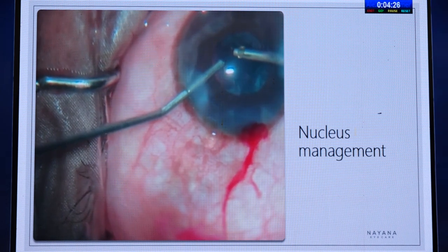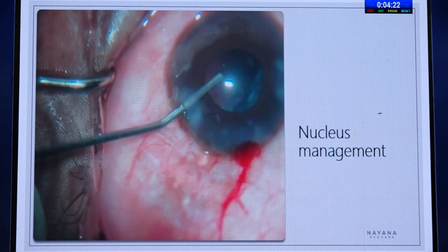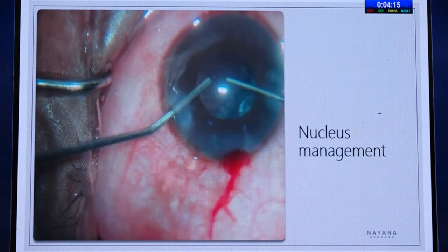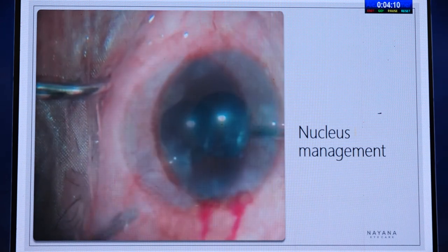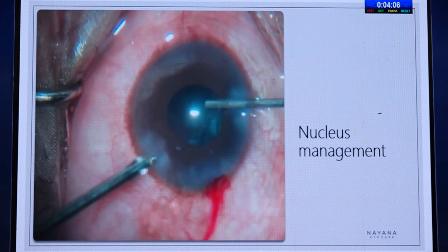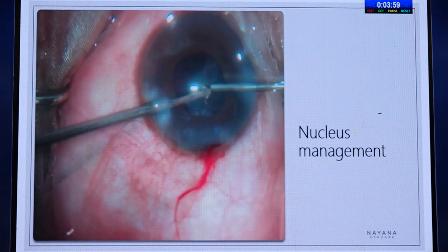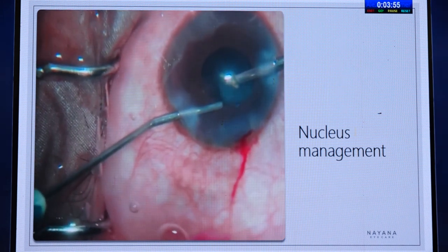If you suspect there is vitreous in the anterior chamber, always first cut and then aspirate. Use triamcinolone acetonide in the anterior chamber if you are unable to visualize the vitreous. If you are sure that there is no vitreous in the anterior chamber, then you can go into the aspiration cutting mode. You can change hands to access the subincisional cortex. This has been possible because it was a grade 1 or 2 nucleus. So if it was a grade 3 or 4 nucleus, probably I would have managed it differently.